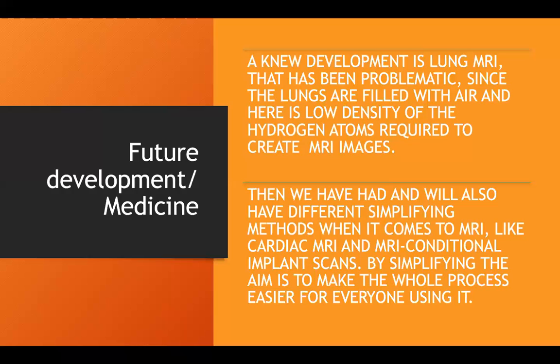As we know from the history, it took a lot of time to come up with this mechanism and to understand it. And it's a tough and long process. So the aim of the future development is really to simplify MRI scans so that it can be easier for the patient, the scientist, and also the doctor, so that the process goes smoothly. And these were two points I found when it came to the development that were connected to the MRI, future development, and also the medical field.